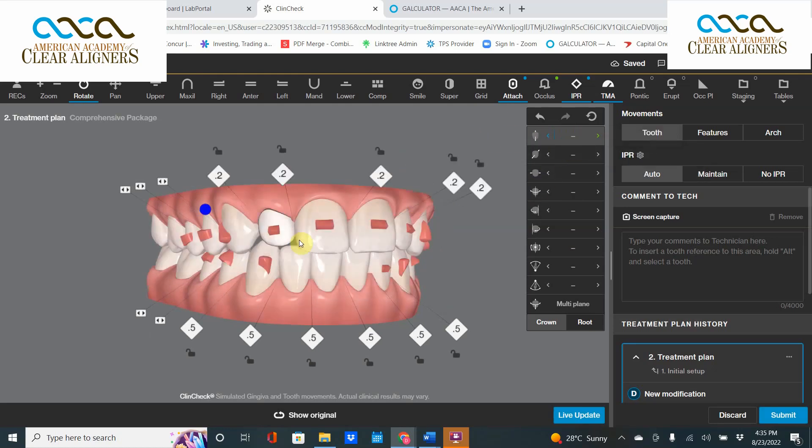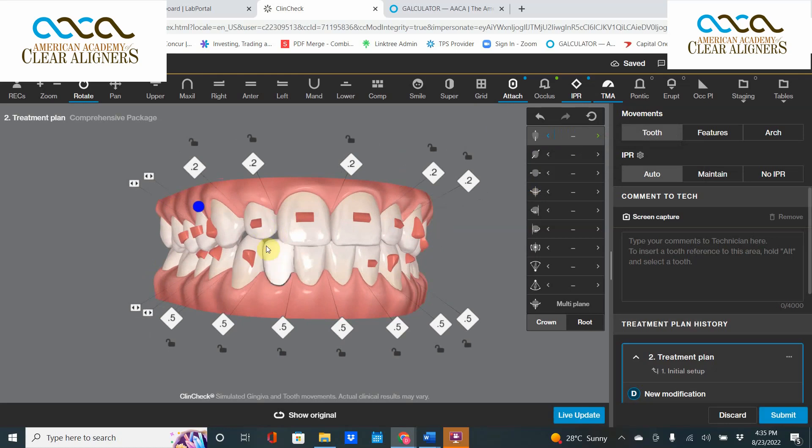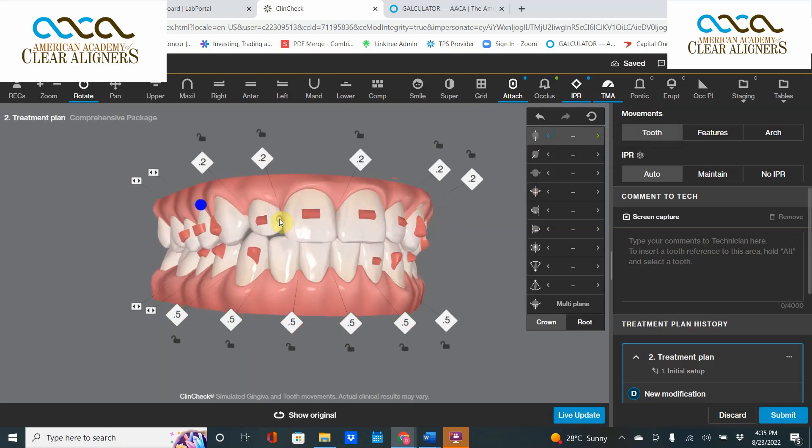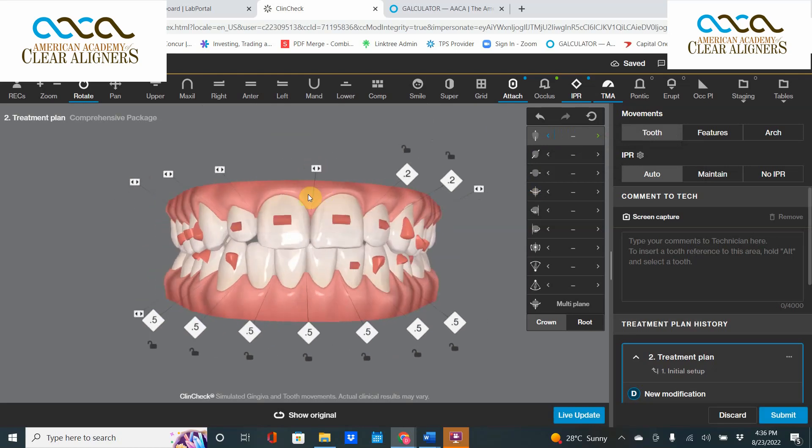Okay, I get it — it's a small tooth right here, and you'd like it to come down. But if you want that small tooth to look bigger, bond it — don't extrude it. If you want that tooth to look bigger, extruding it is crazy. Get rid of this artifact now.